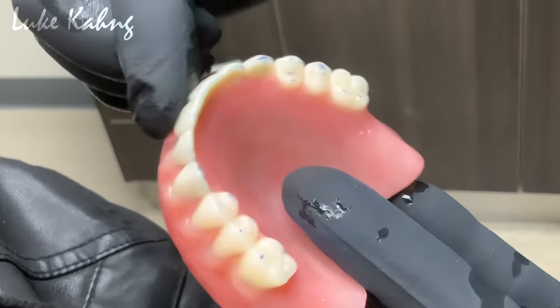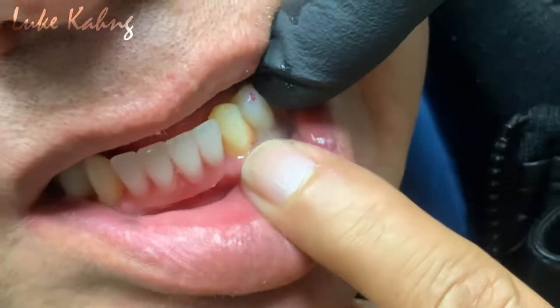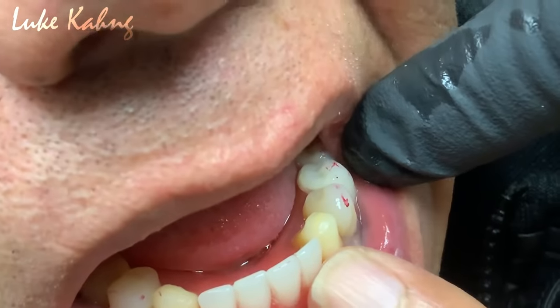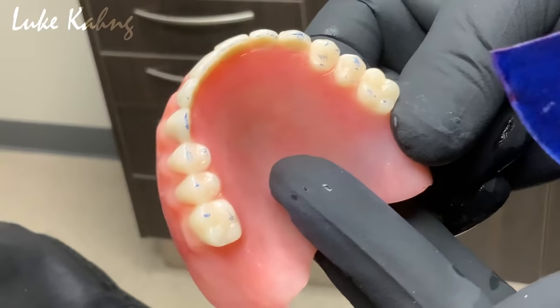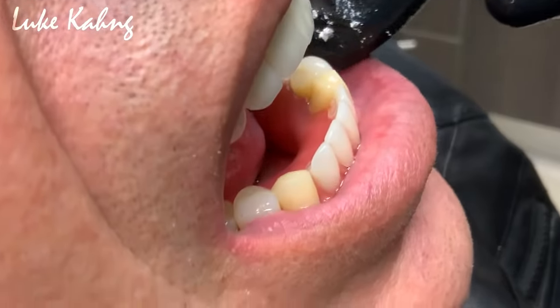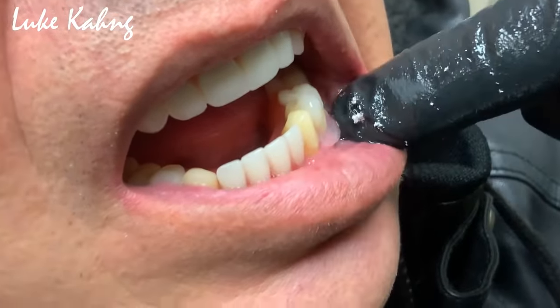So I'm not gonna alter this. I'm actually gonna go down to his flexi, and you can see here he's got a spot there that needs to be reduced and another couple little high spots here. So I'm actually gonna go down and adjust the flexi versus adjusting this upper denture, which is pretty nice, okay? Okay, so we adjusted right here. See that? We also adjusted a little bit on the clear clasp.